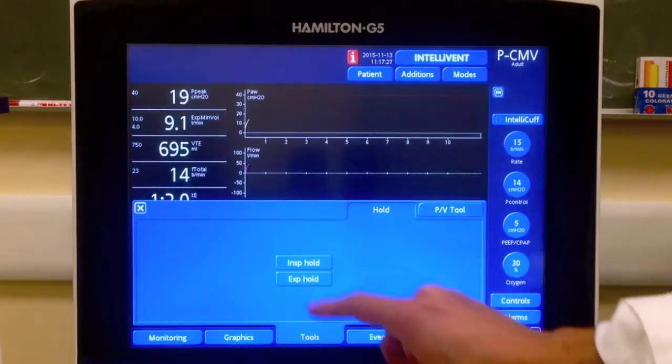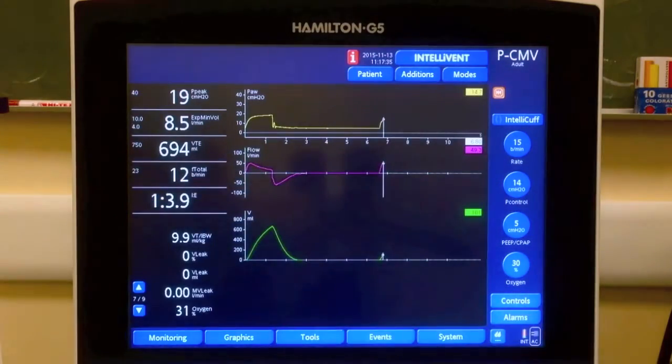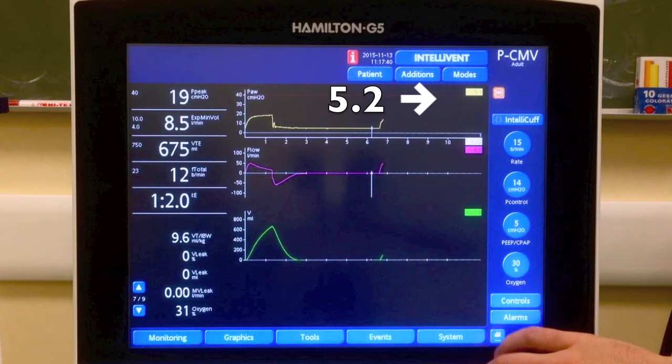In the same way, we perform an expiratory hold measuring the value of the total PEEP. In this case, it is 5.2 cm of water.